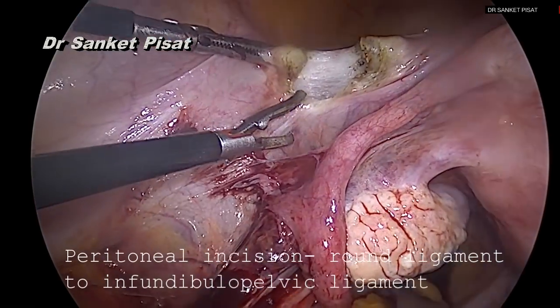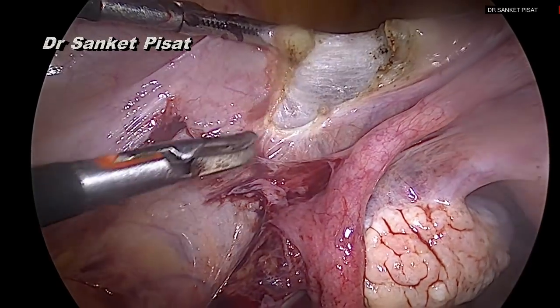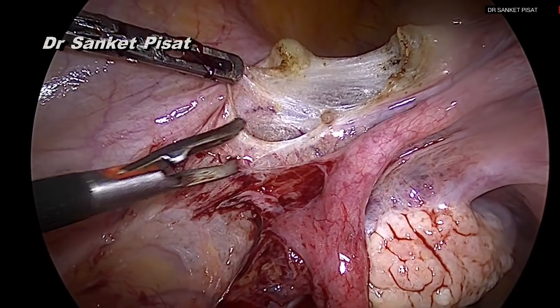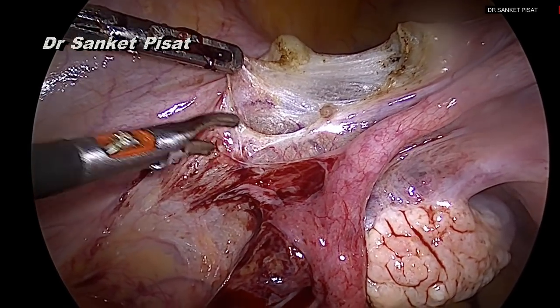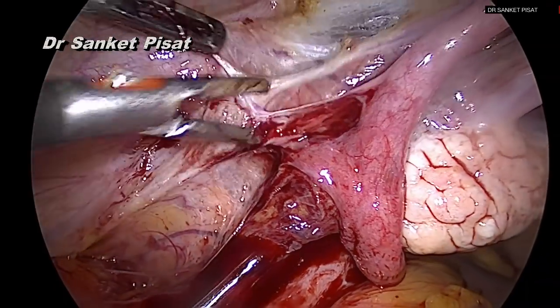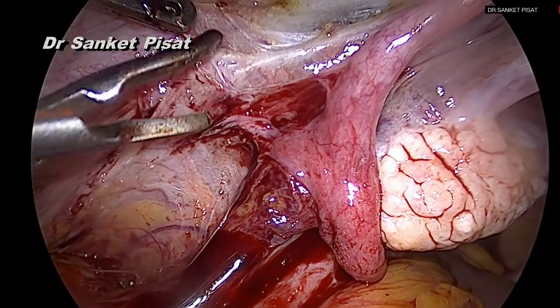The incision is then extended from the round ligament to the infundibulopelvic ligament, keeping the line of incision about one centimeter parallel and lateral to the infundibulopelvic ligament. This exposes the great vessels, and the other advantage of this particular technique over the posterior technique is that there is more space available to the operating surgeon.